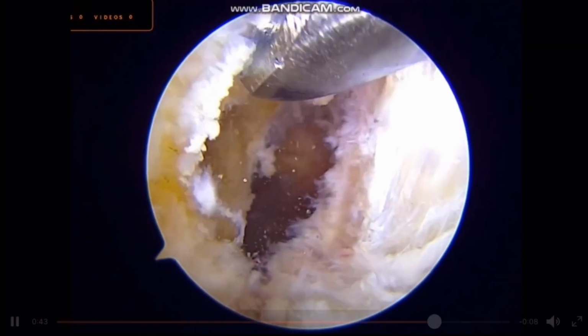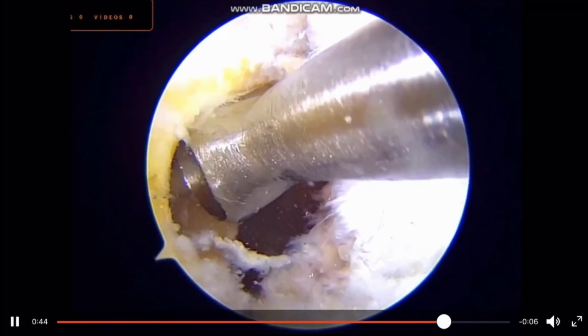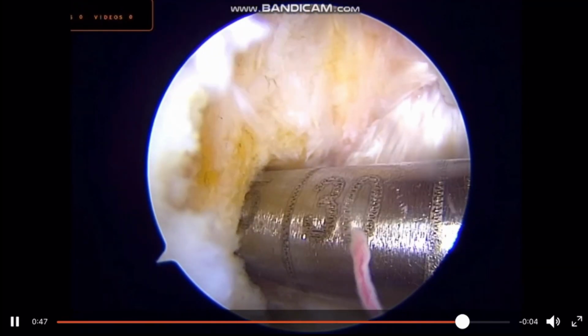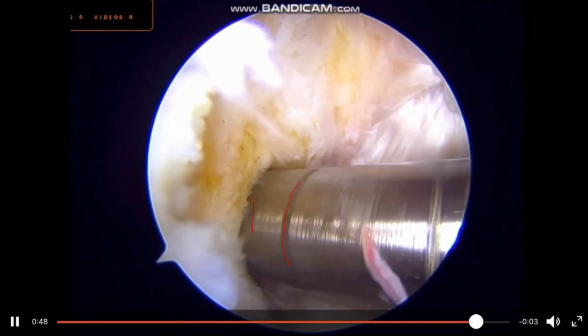Now I am scooping the anterior wall because I am a bit posterior, so I am widening the tunnel anteriorly so that I don't break the wall posteriorly. Now as you can see, this is the 30 mm mark and this is around 27 or 28. I am drilling up till 28 only.